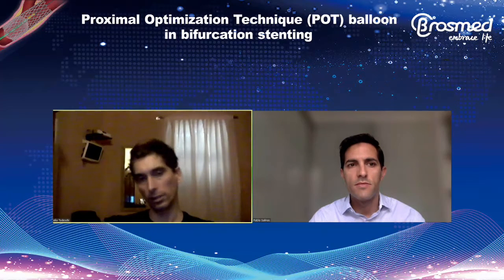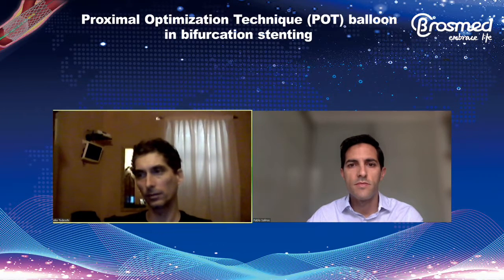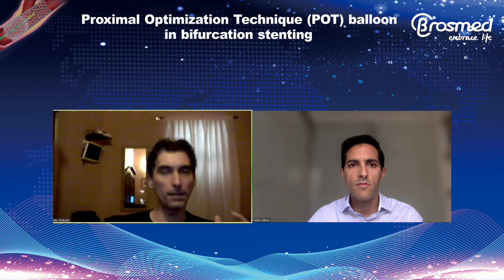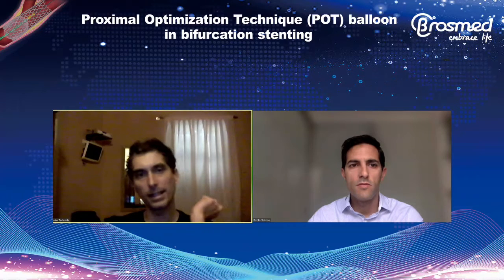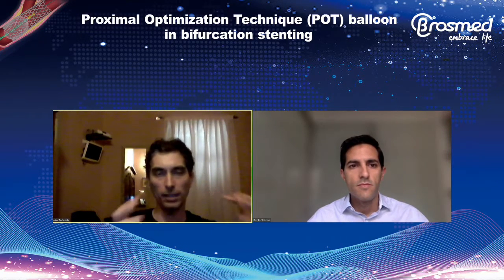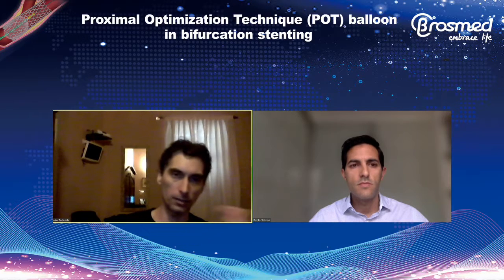I use both. I don't have a rule about that. I use stent magnification a lot, the clear stent or stent boost, to understand the anatomy and the position of the drug stent and the position of the POT, as I showed in the presentation.